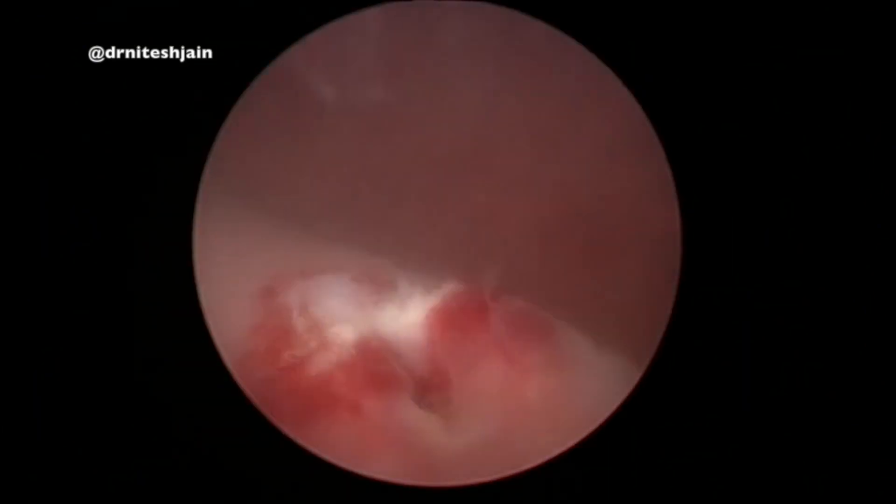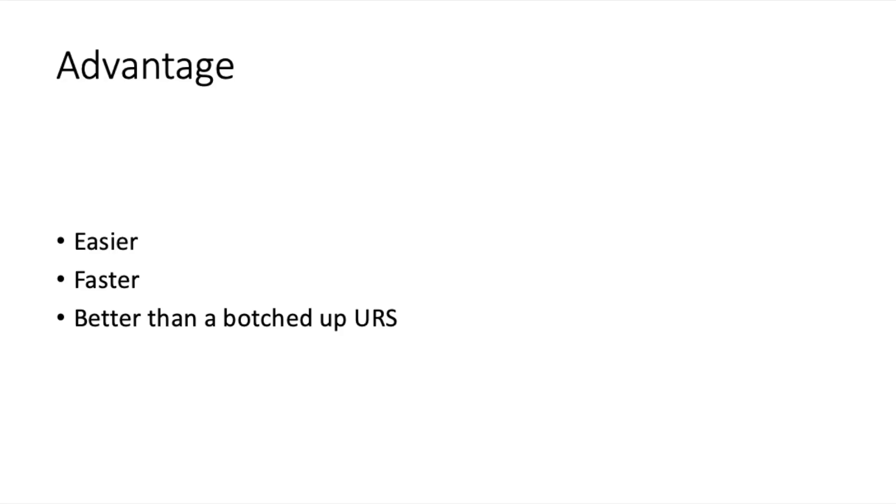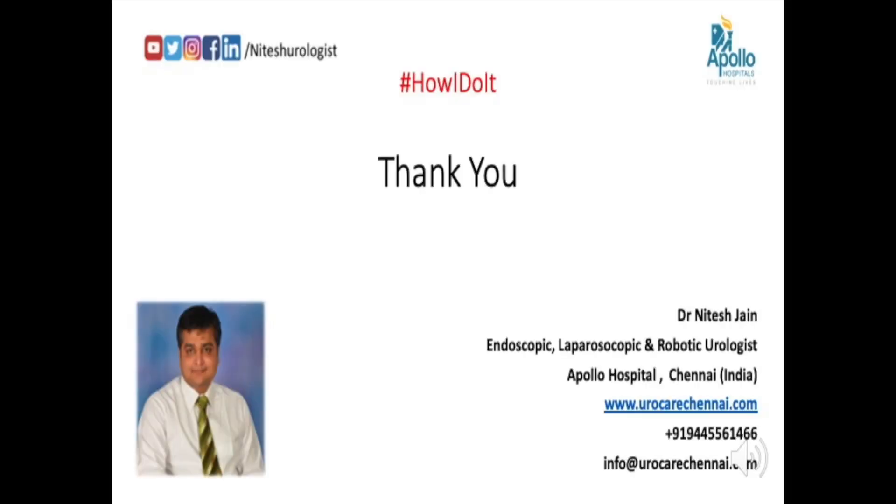The stone can be removed in total and it results in a good meatotomy. The advantage of this procedure is it is very easy to do without causing much injury to the VUJ. These are much faster as the purchase, which is usually not present when we are doing a lower ureteric stone, is not needed here. And usually we don't cause much injury to the VUJ as the cut is a very clean surgical cut.